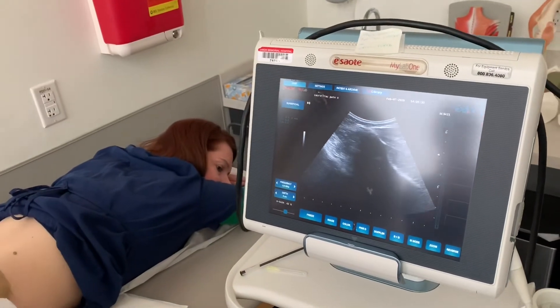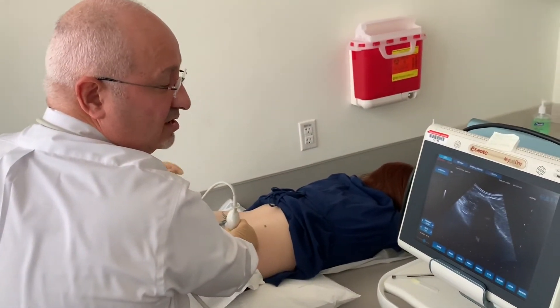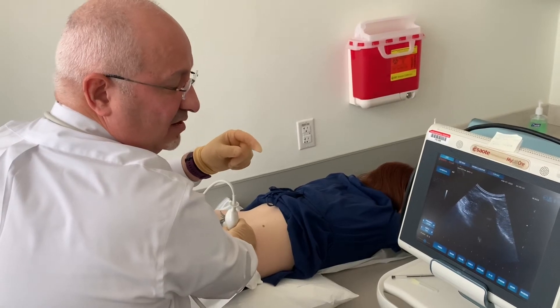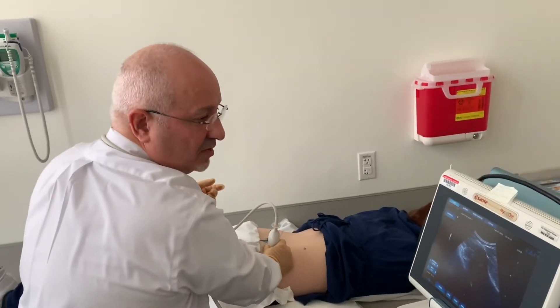If you cannot see the needle tip because it goes deep, you use a hydrodissection technique. When you infiltrate a little bit of lidocaine, you can see expansion of the fluid and turbulence on the ultrasound machine — and that confirms correct placement.